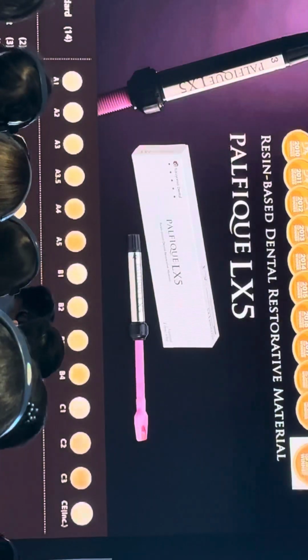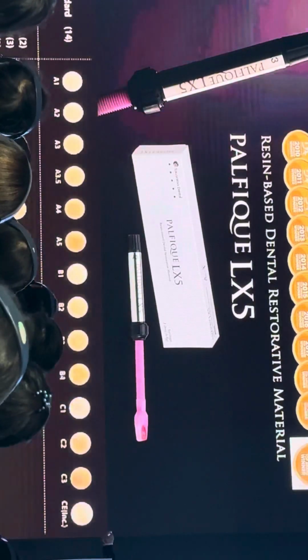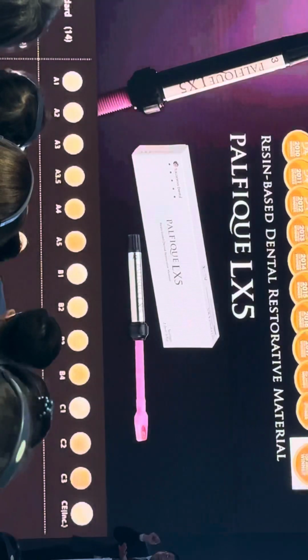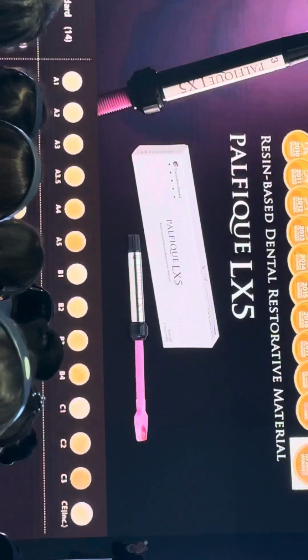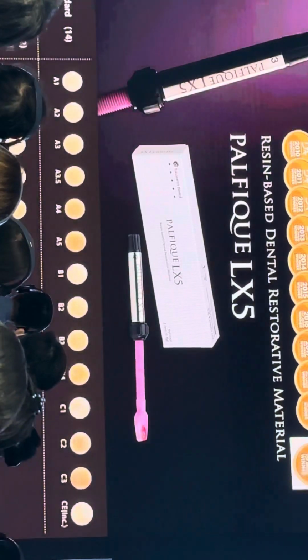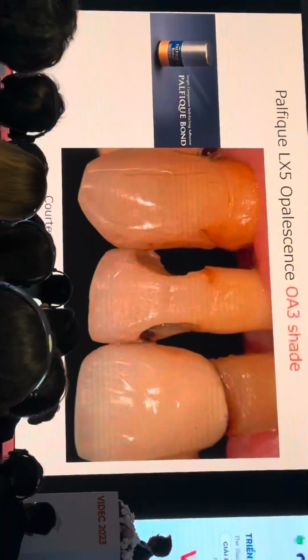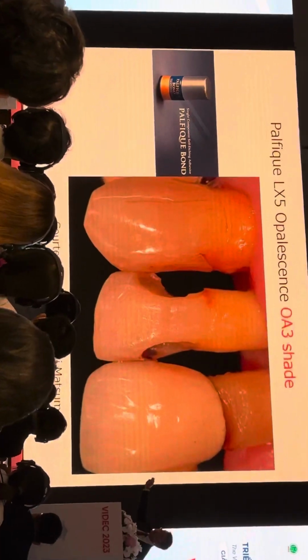And this composite, Palfique LX5, I usually use a lot for aesthetic purposes. When you do the condensation, it's not sticky to the instrument. Very easy to sculpt and manage. Okay, and each layer is 10 seconds. It has a good chameleon effect. It reduces your working time. In this case, because it has a chameleon effect.